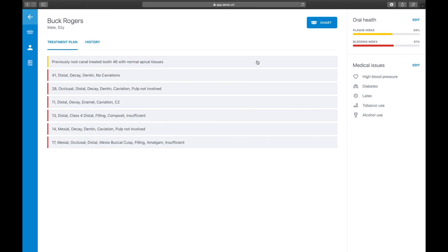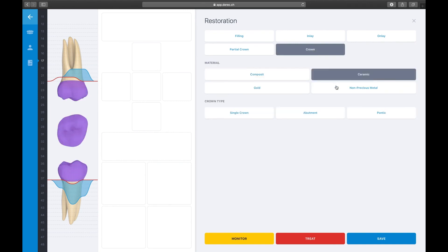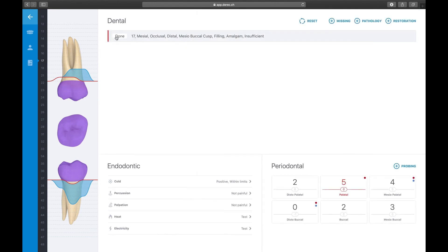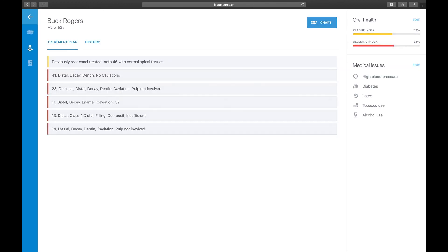Let's take a look at how to update Buck's dental chart through the treatment plan section. In our treatment plan, tooth 17 is marked with an insufficient amalgam filling we have chosen to replace. To update the chart with a new filling, click on the to-do item. Derek will directly jump to the restoration menu on tooth 17. Now you can enter your performed treatment and hit Save. In the single tooth view, hit Done to resolve the to-do. Congratulations — you just updated Buck's dental chart. Please note that the to-do item in the treatment plan section is now gone.